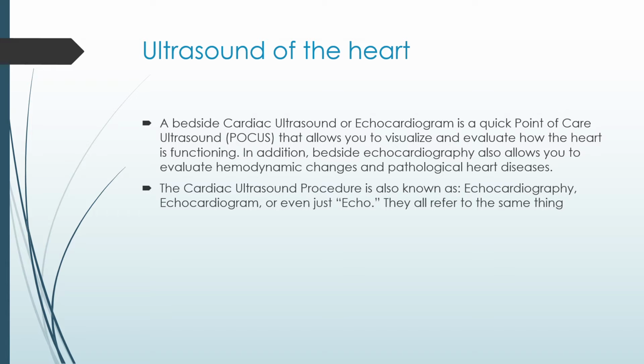And the TEE, which is the transesophageal echocardiography, this is a more specialized cardiac ultrasound. This is used with a special probe, which is inserted into the patient's esophagus. TEE requires sedation and is considered a much more invasive procedure than the TTE.